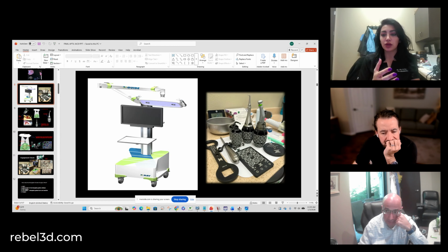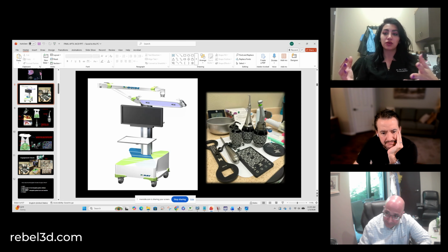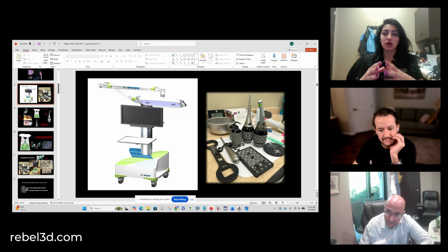So this kind of work comes in advance of surgery. Your assistants, who are your right and left hands, basically, are setting up the system for you. They are setting up the case for success from the start. They're calibrating the system, uploading the plan, and making sure everything is ready for the day of surgery. Our assistants do that the night before to make sure everything is done and ready to go the next morning. So they're calibrating the tracker.